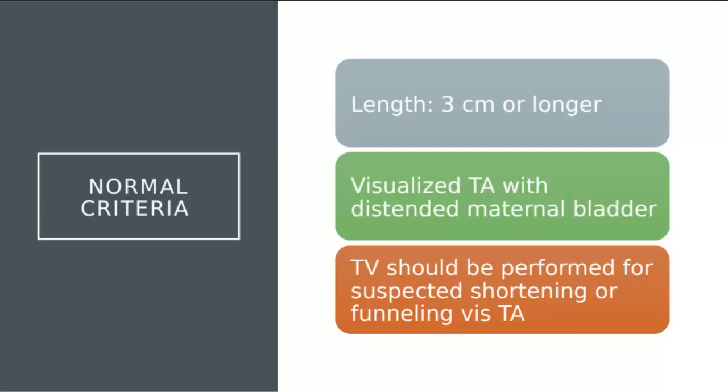Okay, moving into our cervix, moving along here. Cervix is very, very important in terms of our responsibilities, especially when the mom is not ready to be in labor yet. So we want to see a nice, long, closed cervix, 3 centimeters in length or longer. We're visualizing this transabdominally with a very full maternal bladder. So moms don't really like us because they always feel like they have to pee, and then we're making them pee, and then we're making them drink, and then we're pushing on their bladder when they also have a baby pushing on their bladder. So becoming proficient in documenting the cervix is really important if you're going to work in the OB world.